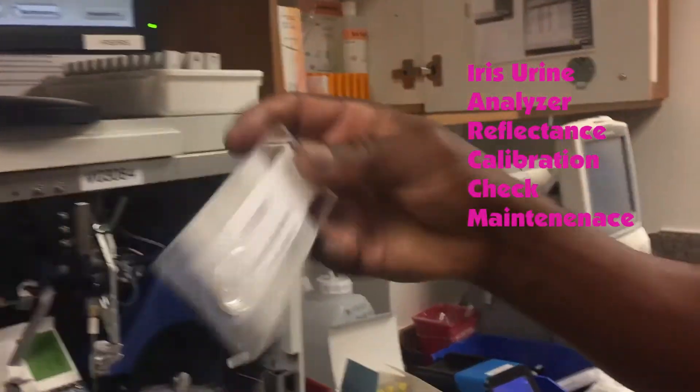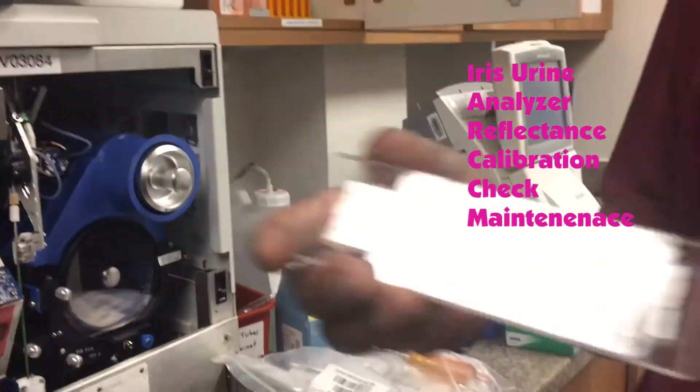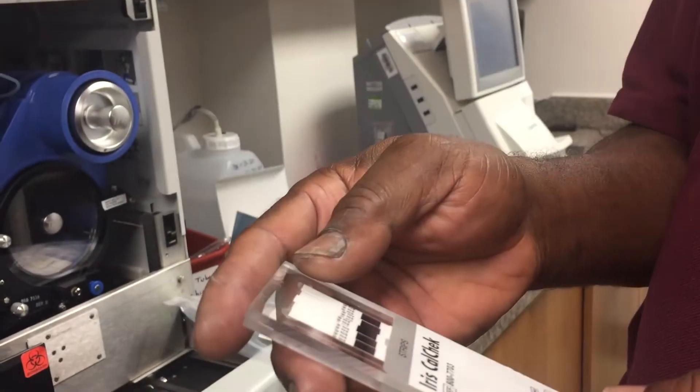You got the strips. And you've got how long to use them? Half an hour. Half an hour to use from it. So you're going to use one whole package — which contains about five strips.